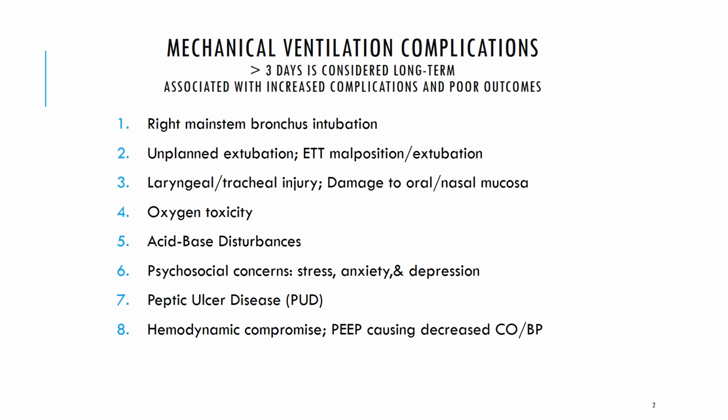So if your heart can't fill up because it has that pressure, maybe that 20 centimeters water of PEEP pushing against it, it's not going to pump out very much blood either. So what do we see? We see a lower cardiac output and a lower blood pressure. So you can start to see how complicated this can get and how important it is to get our patients off the ventilator as soon as it's appropriate.